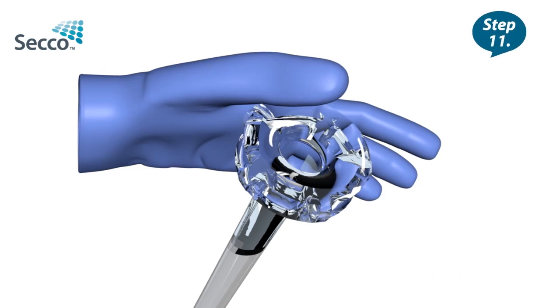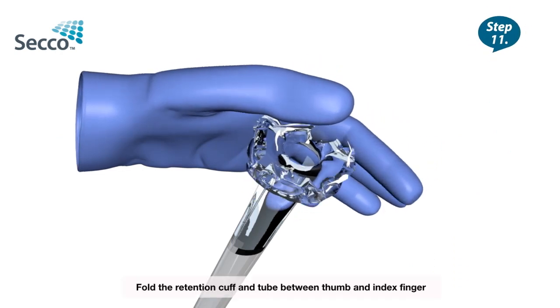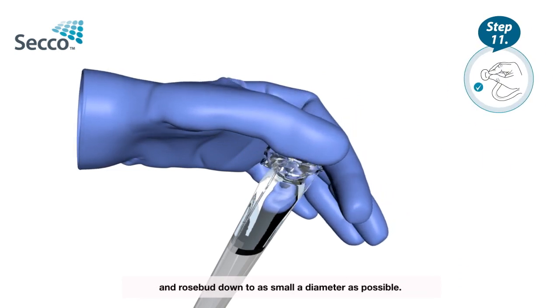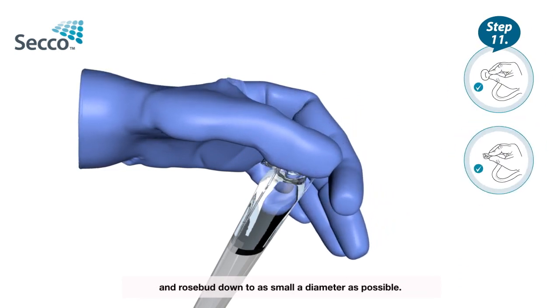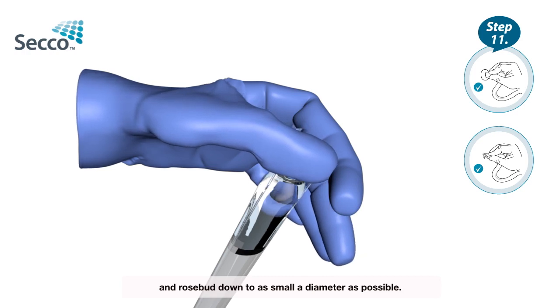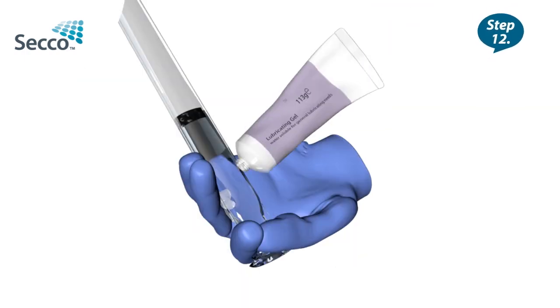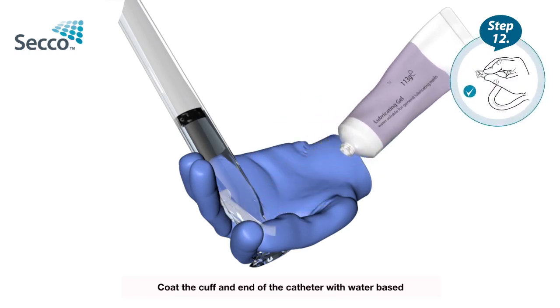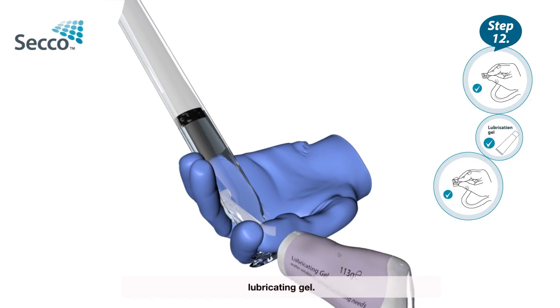Step 11: Fold the retention cuff and tube between thumb and index finger and press down to as small a diameter as possible. Step 12: Coat the cuff at the end of the catheter with water-based lubricating gel.